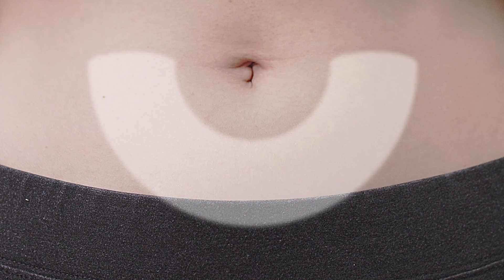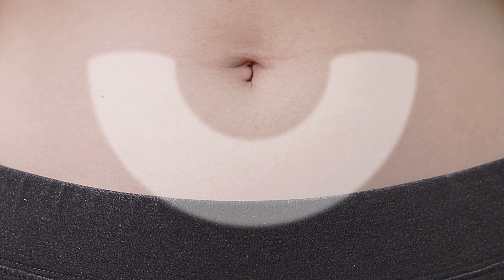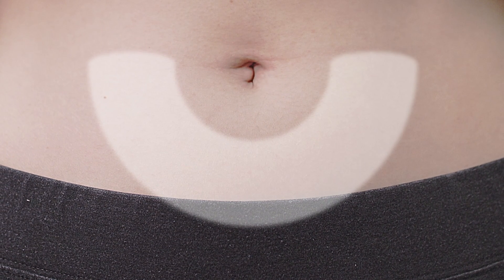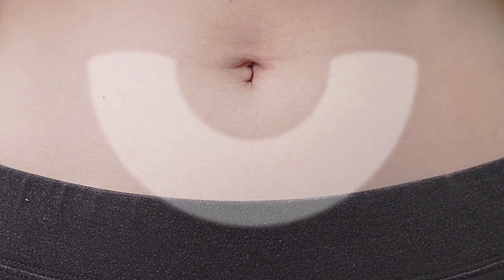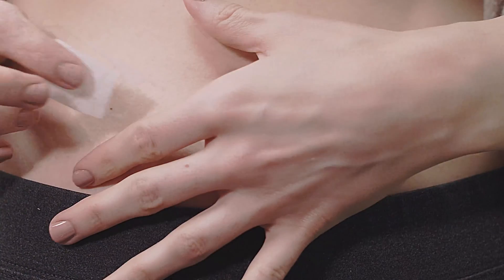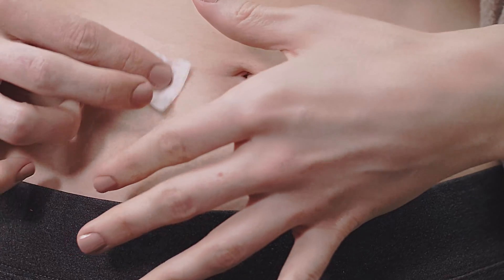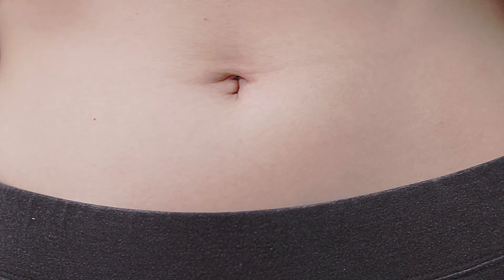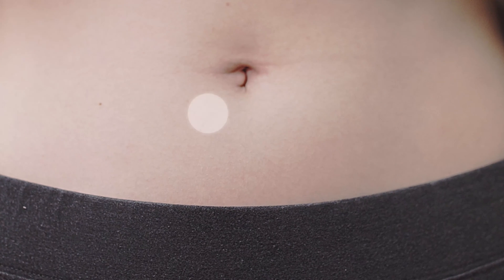The injection site will be a subcutaneous location that has been specified by your physician. The most convenient site for the subcutaneous injection is in the abdomen at least 2 inches away from the navel. Use the alcohol prep wipe to clean the injection site and allow the patch of skin to dry. You may choose to alternate injection sites as needed.